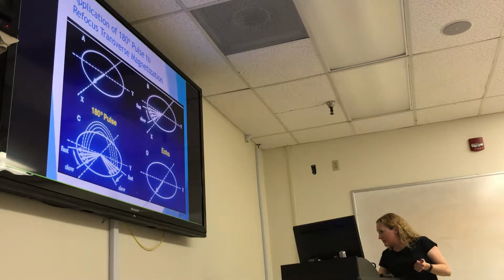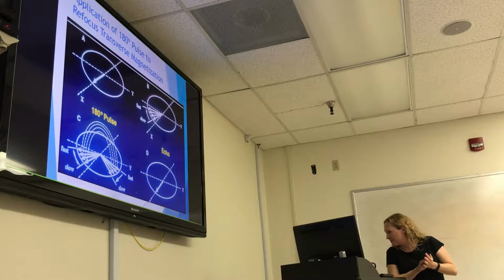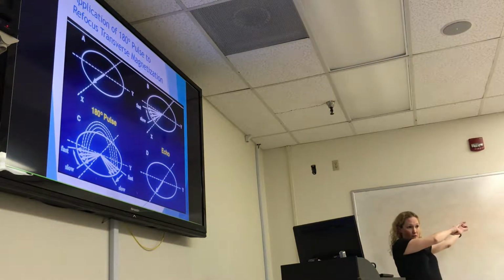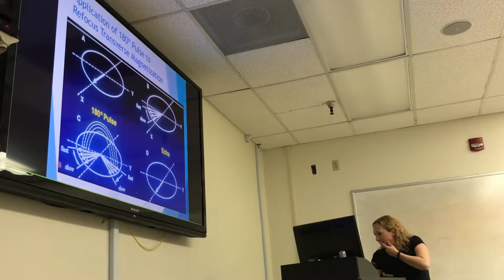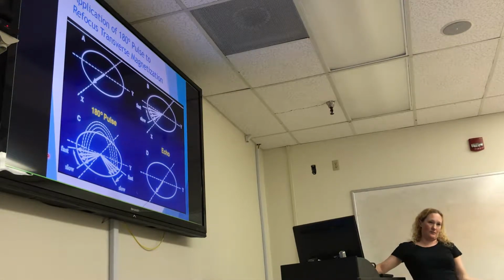Let's see, another question from the homework. Why does the 180 degree not flip it into the opposite direction on the x-axis? Well, yes, it does. So it would go from, say, here to here, but again, still transverse, all right? The 180 pulse rephases. So we're rephasing, so we get the strongest possible signal.